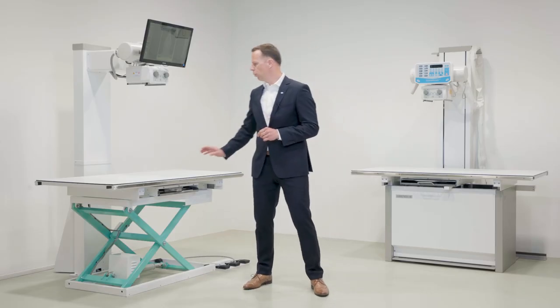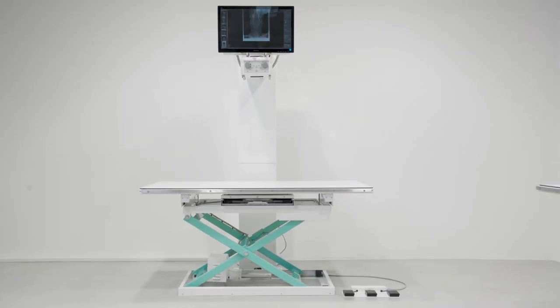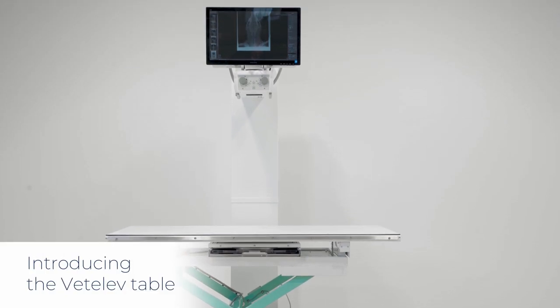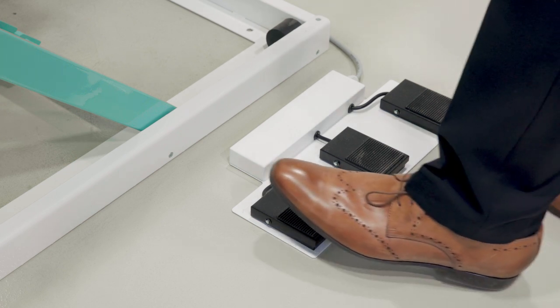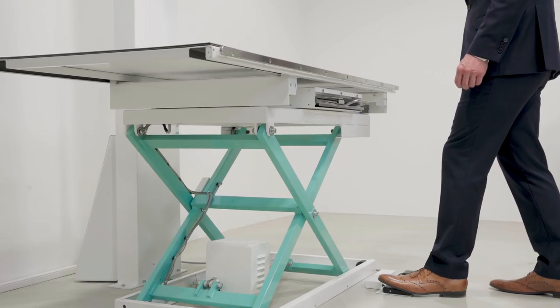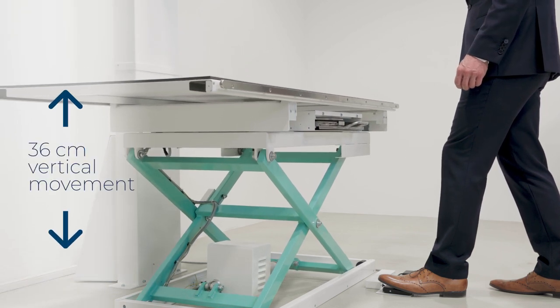Let me first show you the ZooMax Gold system. The ZooMax Gold is a fixed tube setup which comes with either the standard fixed height table or a brand new Vetelev table. The new table is a simplified and cost-conscious version of a popular Phoenix medical patient table. It easily lifts over 100 kilograms and has a vertical movement of 36 centimeters.